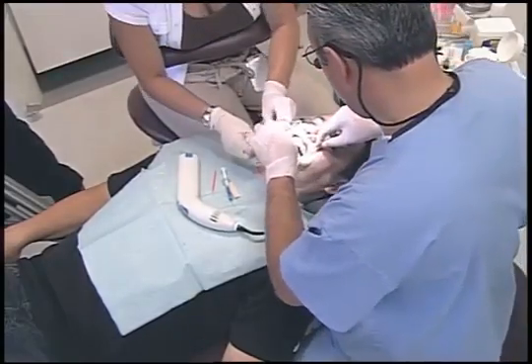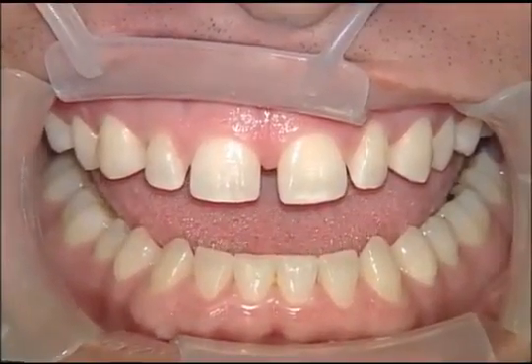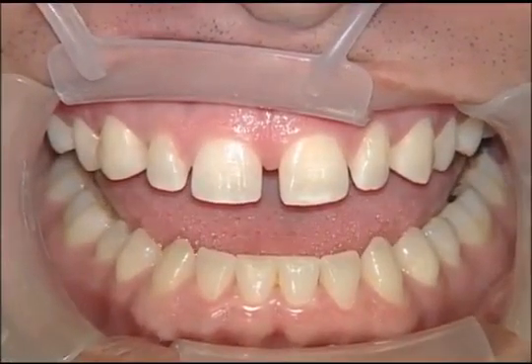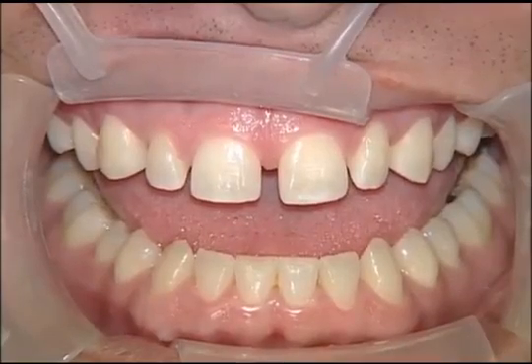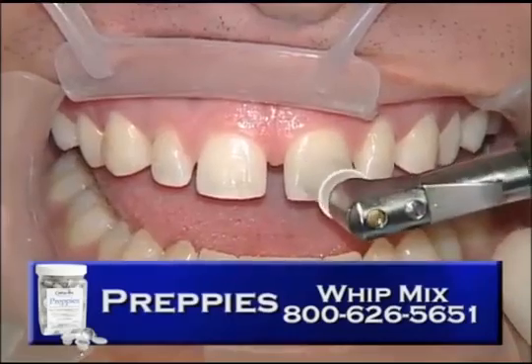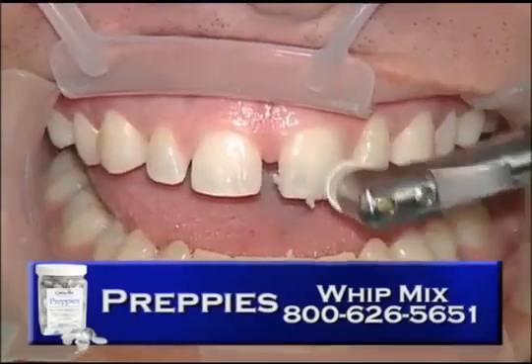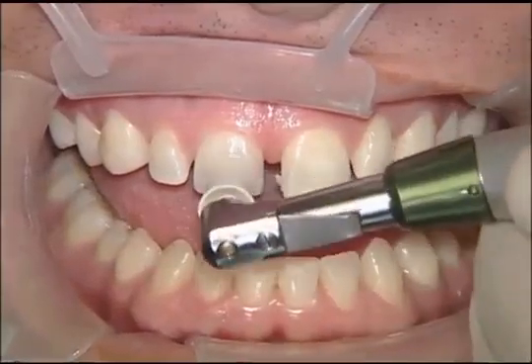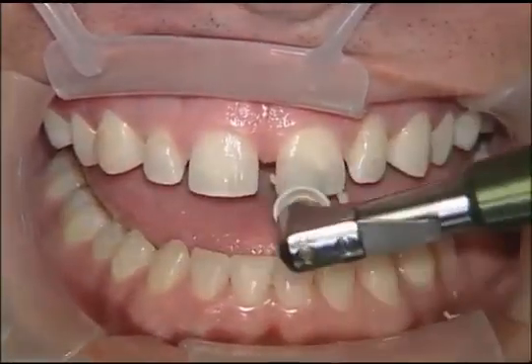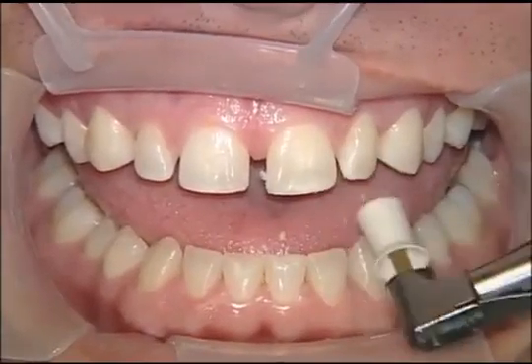And we already tried the veneers in, and Chris was happy with how they look. So we're going to go ahead and begin the bonding procedure at this part, and you'll get a chance to see them once they are in place. We're using some pumice here. I like to use Preppies from Whip Mix in a slow speed handpiece with a Prophy cup. And we're doing this to clean the tooth and remove any pellicle that might be on the tooth, and just make sure that we have a nice bonding surface here as we get ready to etch the enamel.